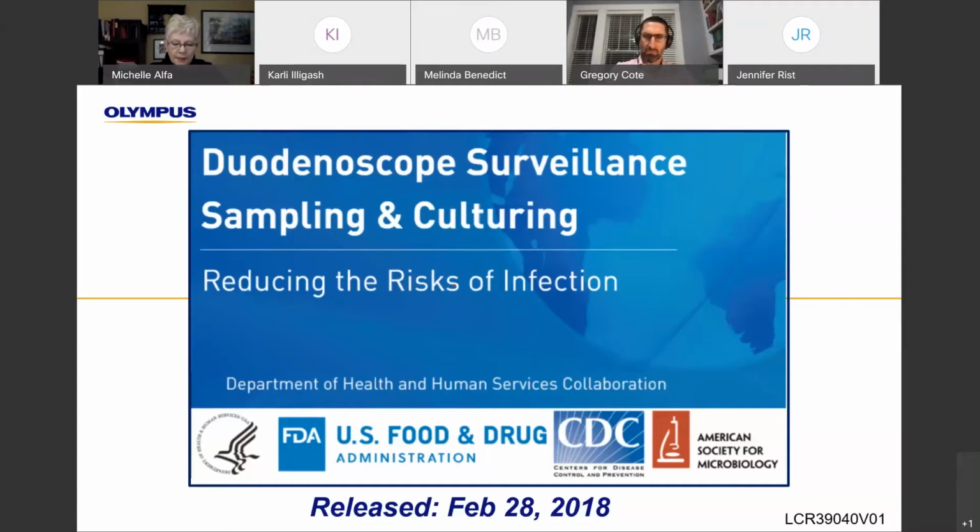One that has been bandied about is the use of the rapid ATP tests. There is a sense that this is a rapid test, and if it were able to detect very low levels of organisms, it would be a great silver bullet to answer our question, when we start an endoscopy procedure, as to whether or not that scope is safe to use because it's not contaminated with organisms.